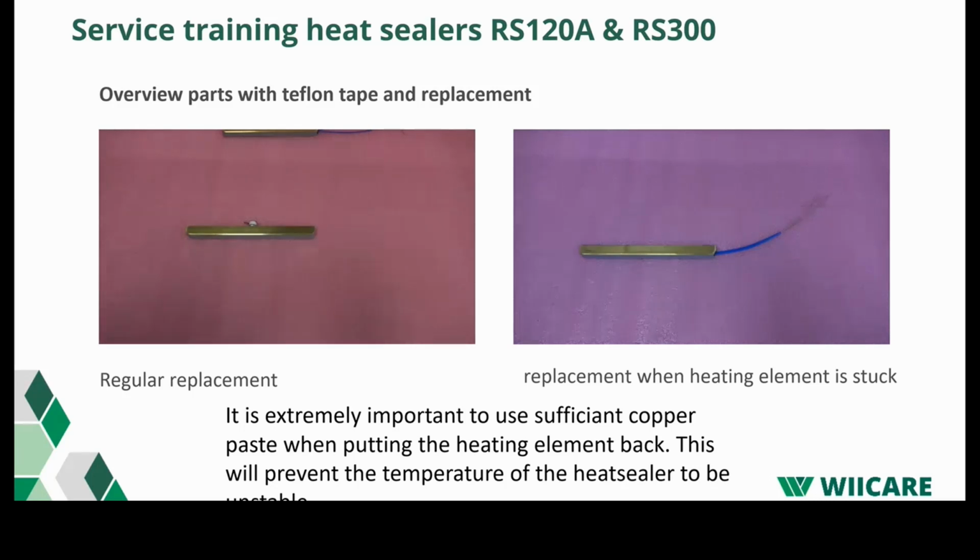Next I show you how to replace the tape on the heating elements. Unscrew the screws and remove the old tape. Clean the surface with a degreaser. This is very important.